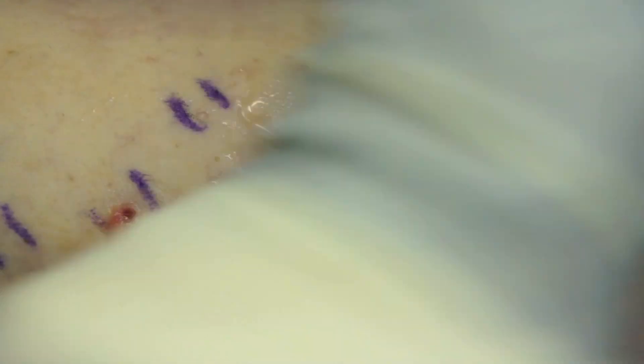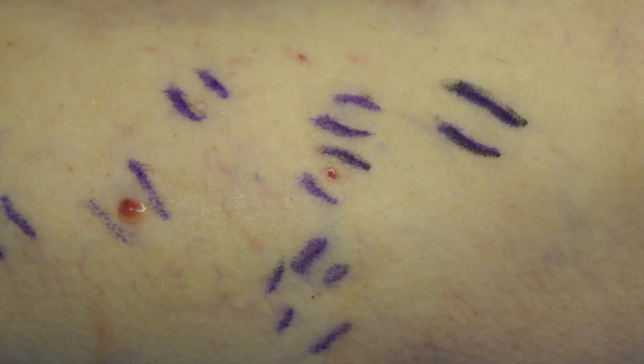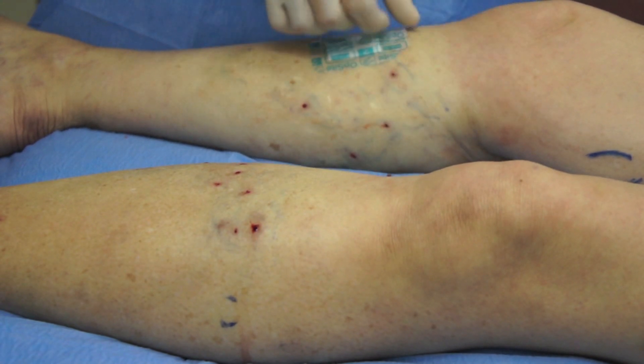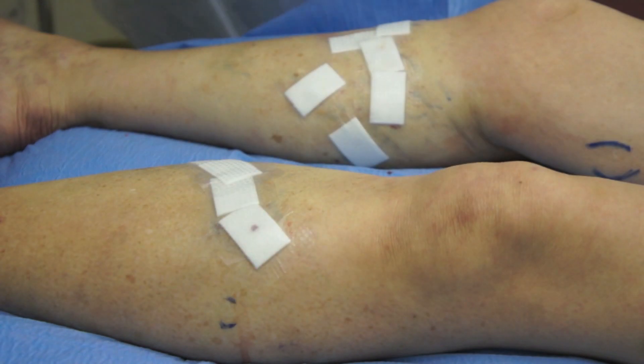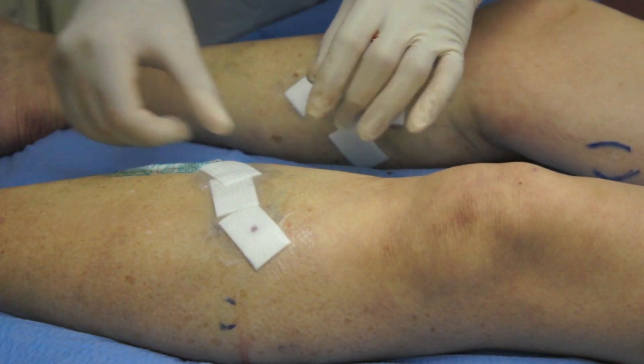There is intense vasoconstriction using Klein's tumescent local anaesthetic, and so there is virtually no blood loss. The 1mm defect retracts further in size as the fluid discharges from the defect. Wound tapes are not required, and a slightly absorbent dressing is applied to each site.